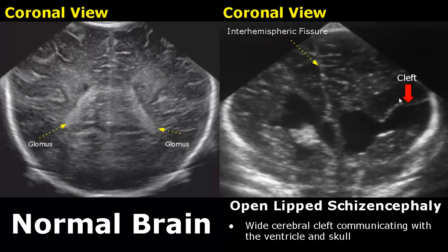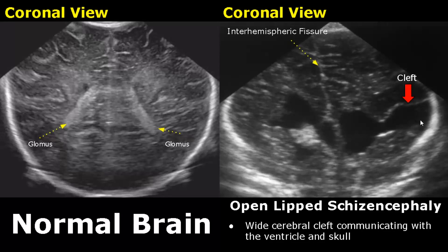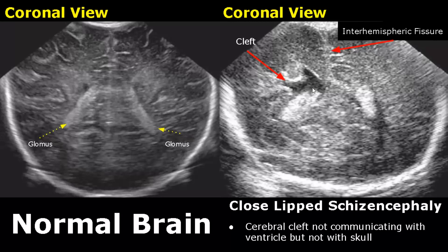In schizencephaly, clefts are found within the brain. It has two types: open-lipped and closed-lipped. In the open-lipped type, the cerebral cleft communicates with both the ventricle and the skull — the cleft has reached the skull bone. In the closed-lipped type, the cleft is connected to the ventricle but not the skull — the cleft is just around the ventricle.